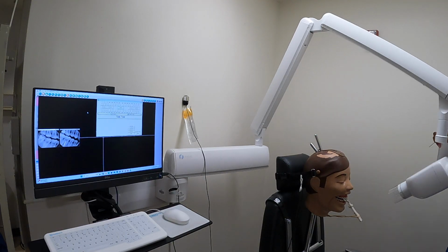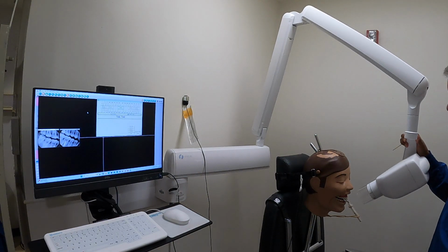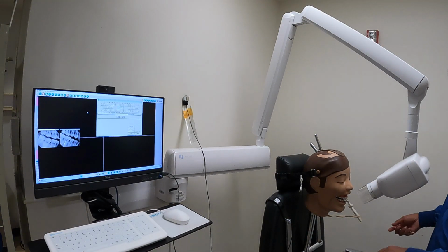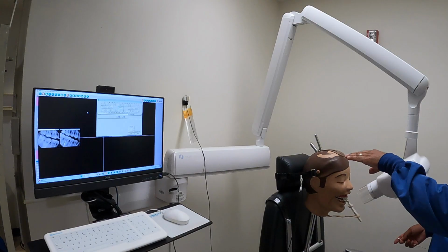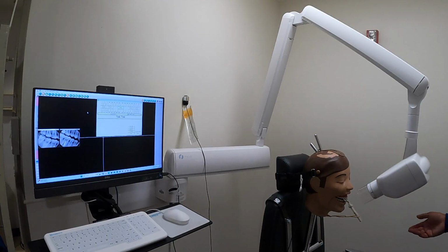So I'm going to point this PID horizontally in the same direction as my eyes. It's going in this direction, okay? But it's still not covering the film. It's really low, and it needs to go higher, obviously. So we've got our vertical, we have our horizontal. Now let's cover the film.